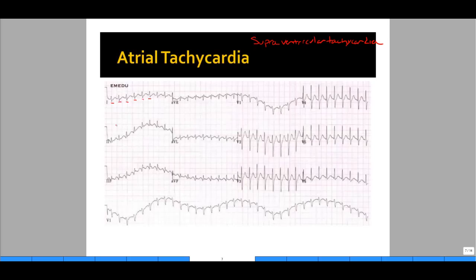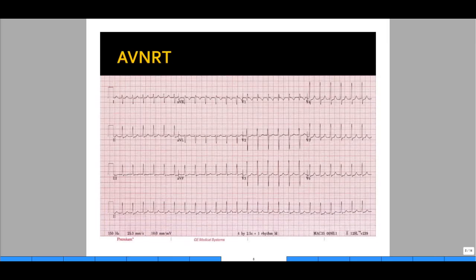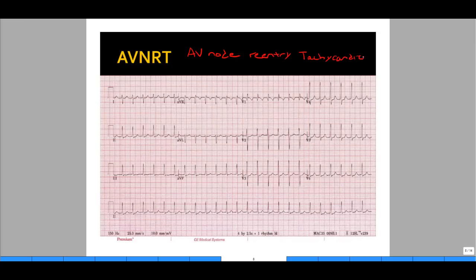Usually supraventricular tachycardia ranges from 150s to 160s. Another type of supraventricular tachycardia is AVNRT — AV node reentry tachycardia — where there is an accessory pathway that essentially causes a looping of the depolarization causing tachycardia. It will look exactly like regular SVT, with a narrow complex QRS and difficulty finding the P wave, because it's either buried in the QRS or just after the QRS complex.